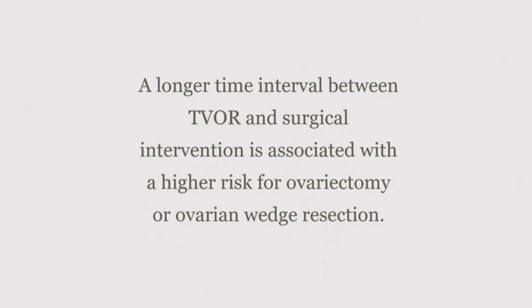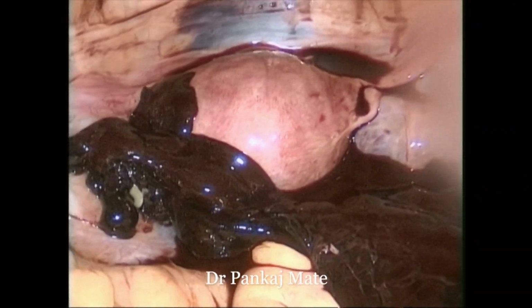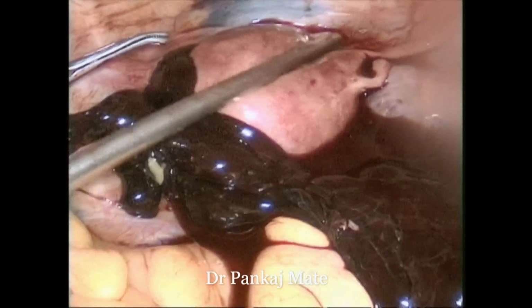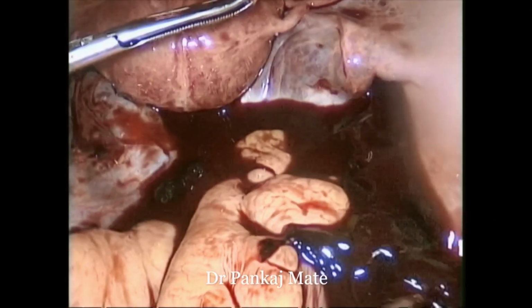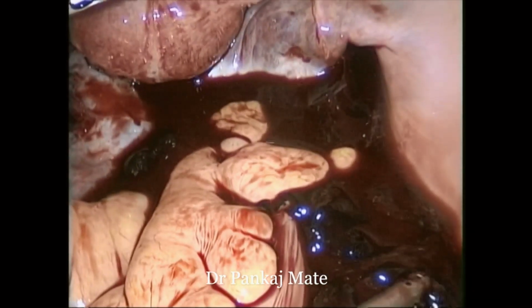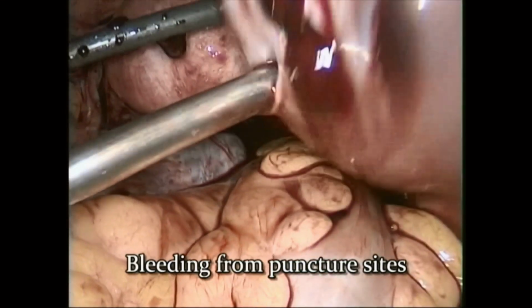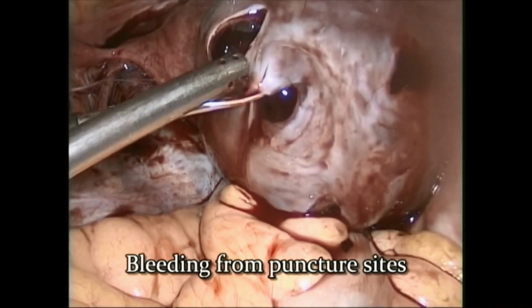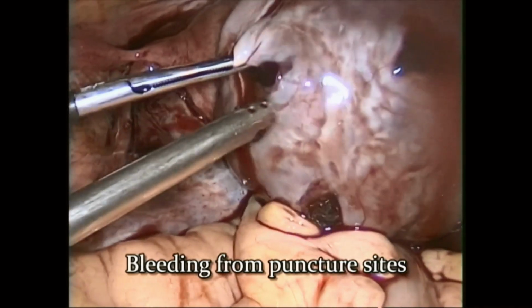A longer interval between TVOR and surgical intervention may end up in removal of the ovary. Here you can see a gross hemorrhage after oocyte retrieval. The problem with these ovaries is that they are too fragile, so it is a bit difficult to attain hemostasis. You can see all the puncture sites bleeding, and it is a bit difficult to achieve hemostasis.